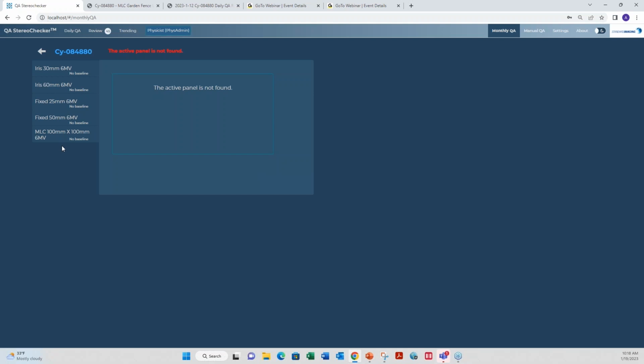I personally would recommend that when you set this up, you create a monthly QA test for each of the iris sizes, in addition to the daily one for the iris batch. The reason being that baseline value for both daily and monthly, you're testing against that, right? The idea of changing a baseline on the fly, well, some promote that as a real feature and benefit to customers. It's not. QA should be rigorous and against a baseline.